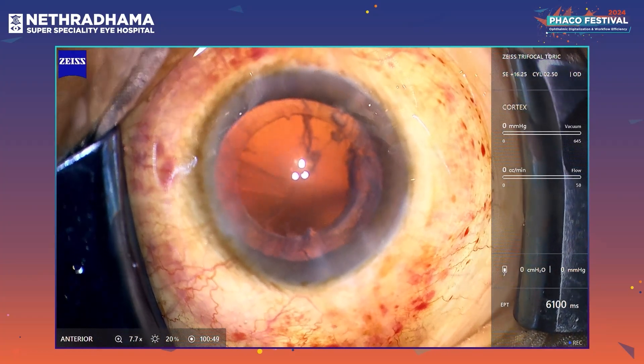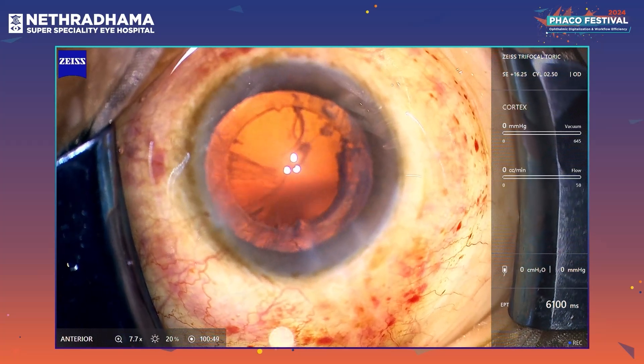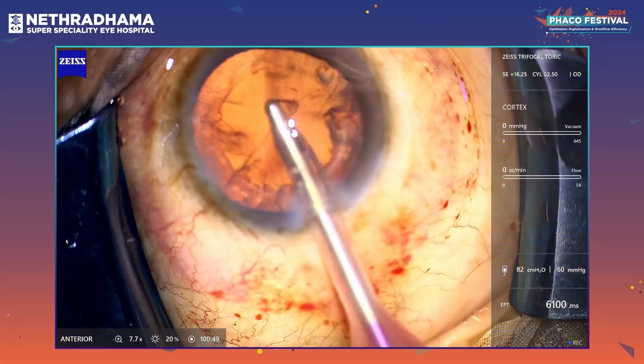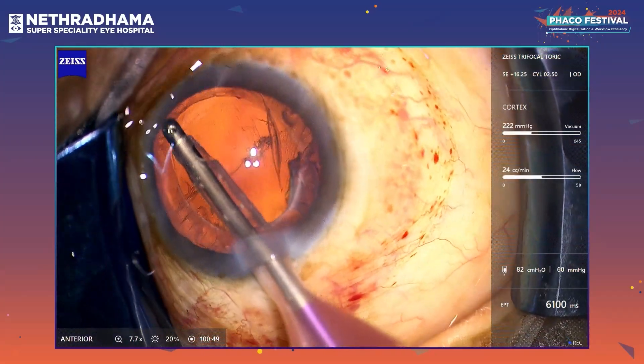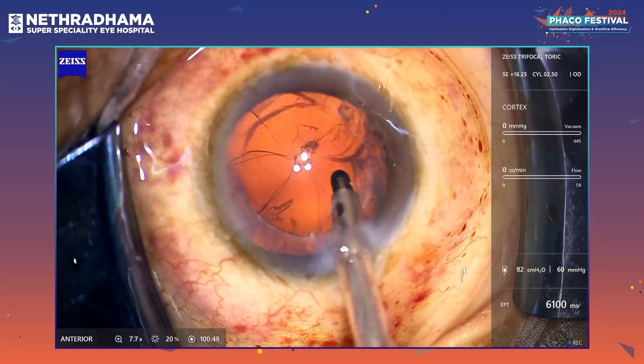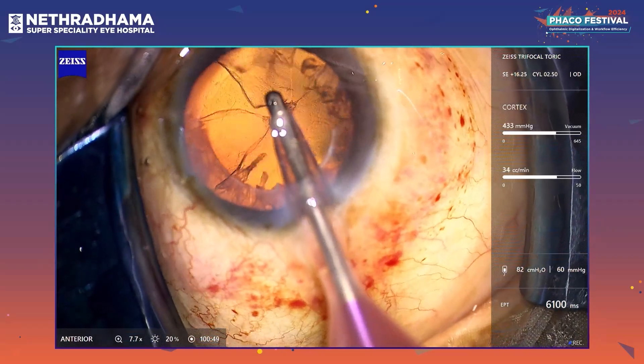You can see that the nubs are quite stable and it gives me a very clear idea of where I need to align the lens. The IOL I will be using today is the ATLISA trifocal toric lens — it's a diffractive lens with a bitoric surface.